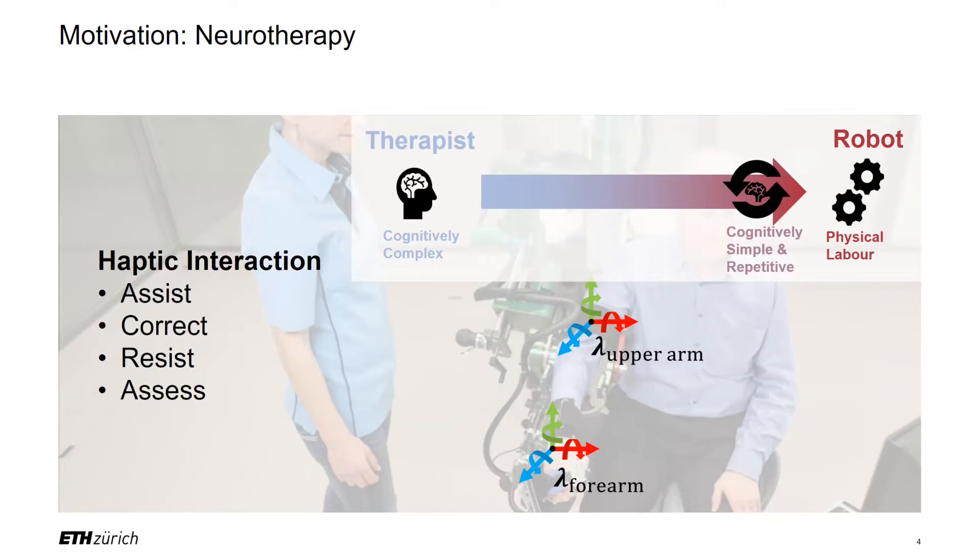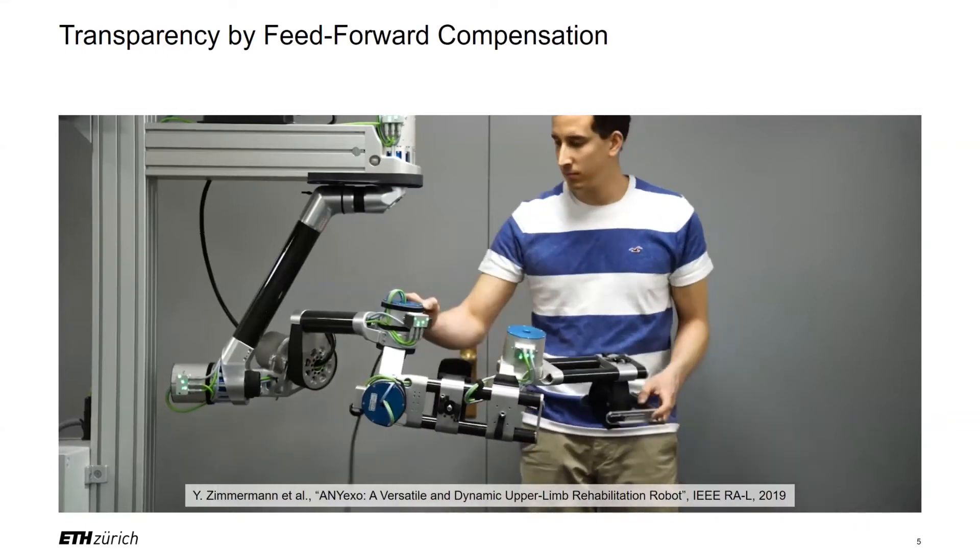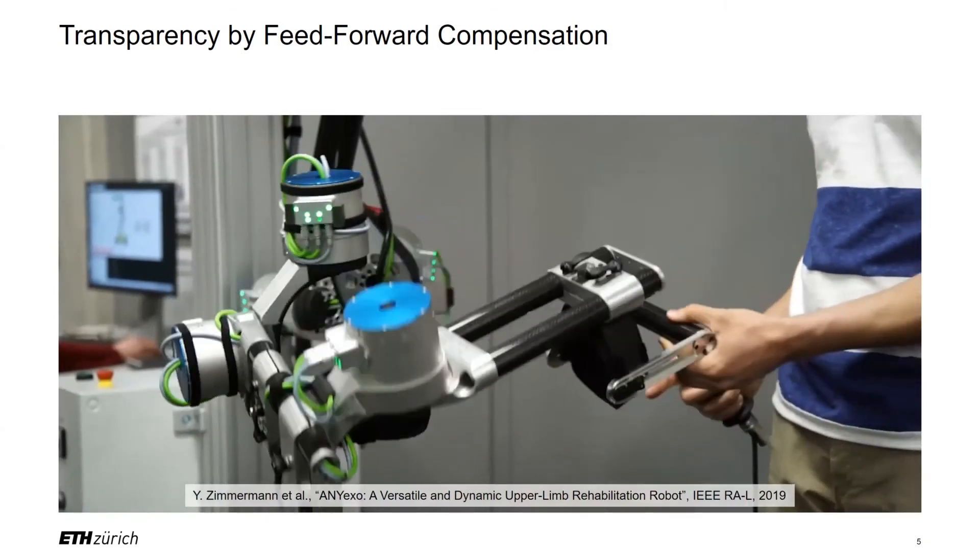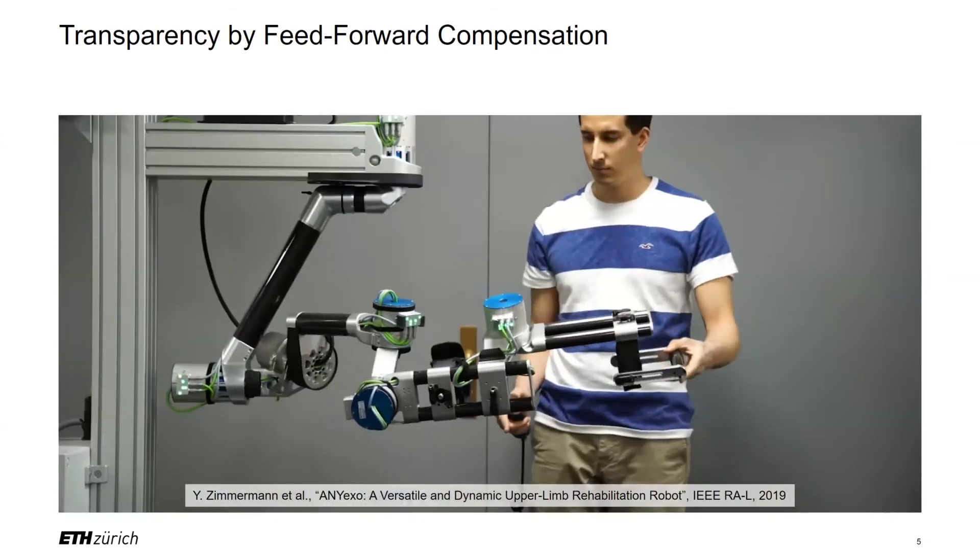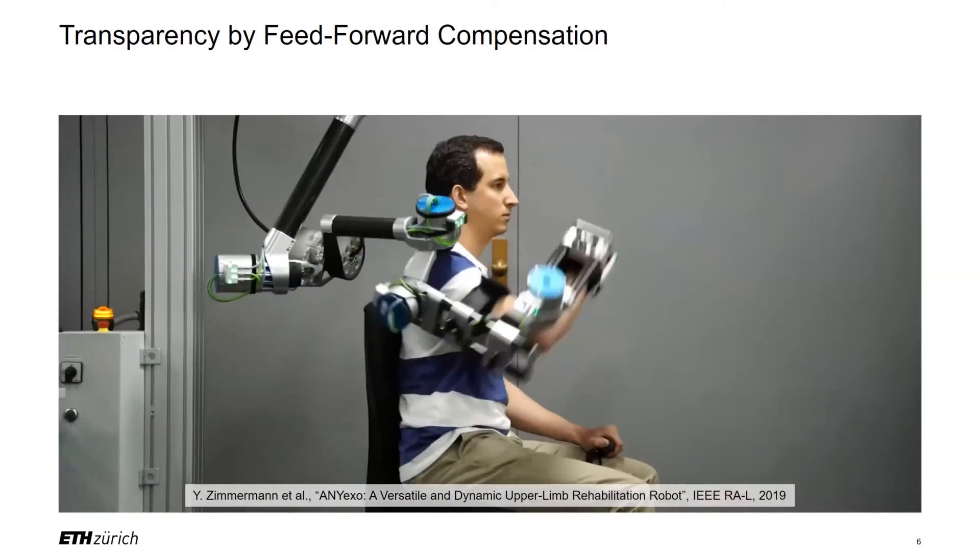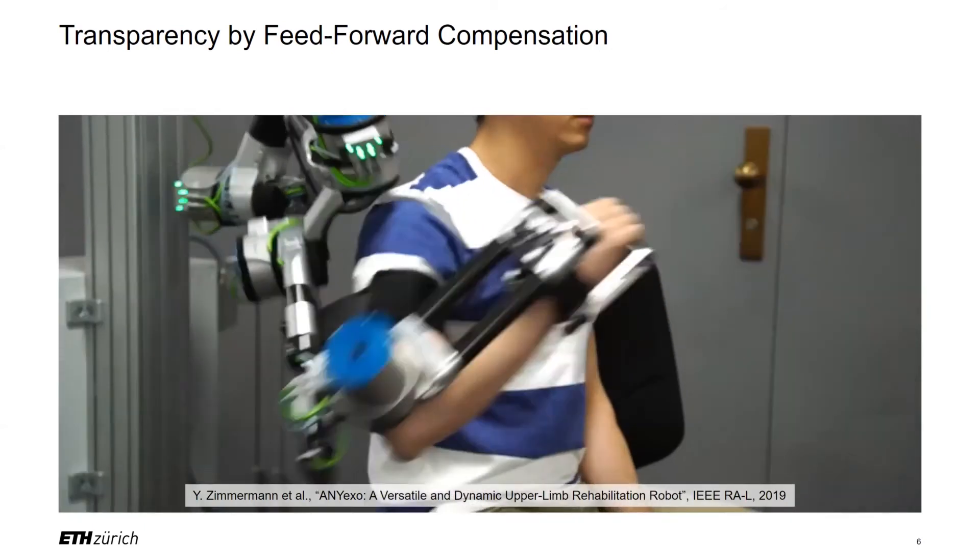With rehabilitation robots, we want to achieve a similar or even better performance. Let us have a look at what was achieved so far. To demonstrate the performance of the hardware, we were using a simple feed-forward controller to compensate the robot's gravity, Coriolis and centrifugal terms. As you can see, the exoskeleton is controlled such that I am able to move quite freely. We could demonstrate that the gravity load of the robot can be compensated accurately.